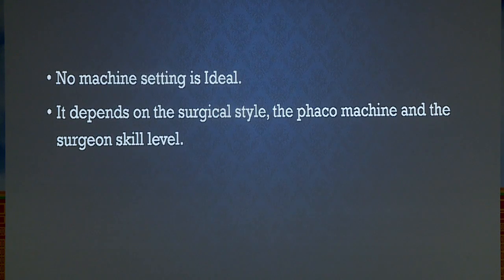Lastly, no machine settings are ideal. It depends on the surgical style, the phaco machine and the surgeon's skill set.